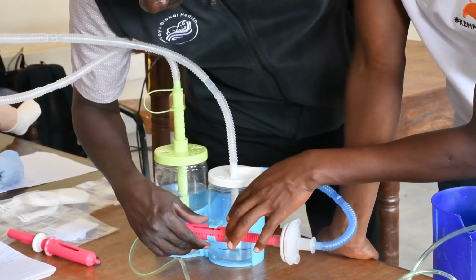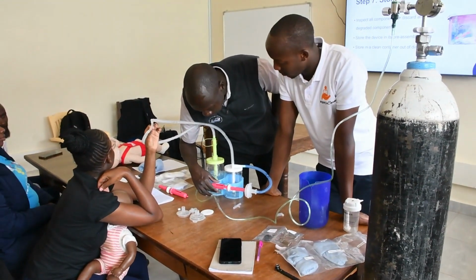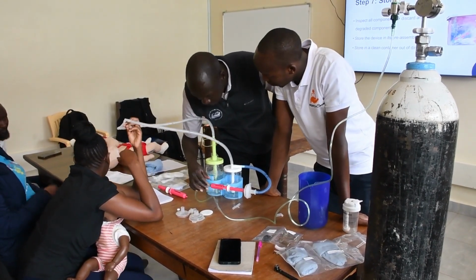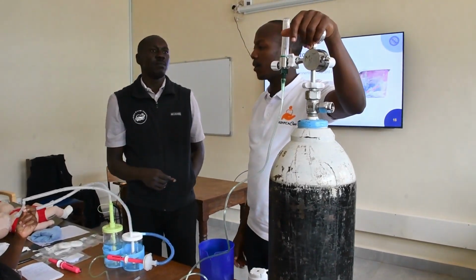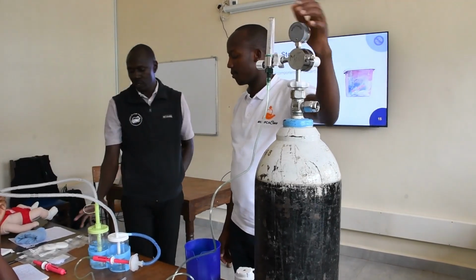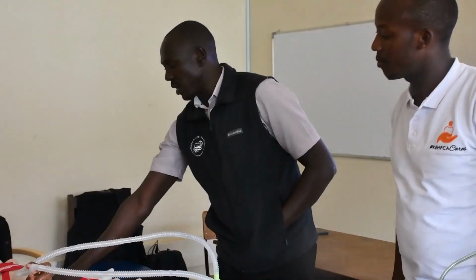We are holding now. Sometimes the pressure coming out may be less, that's why. Once the leak test is successful, then we can come to patient application.